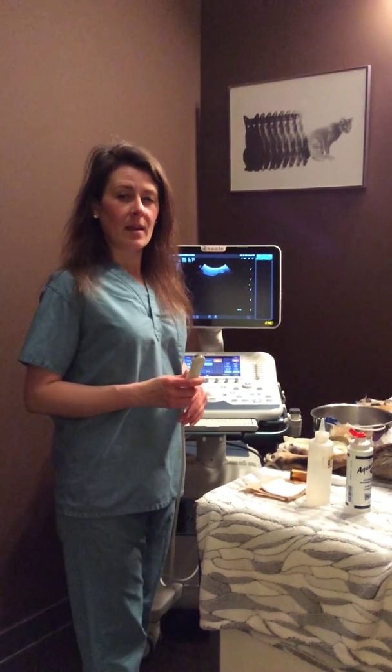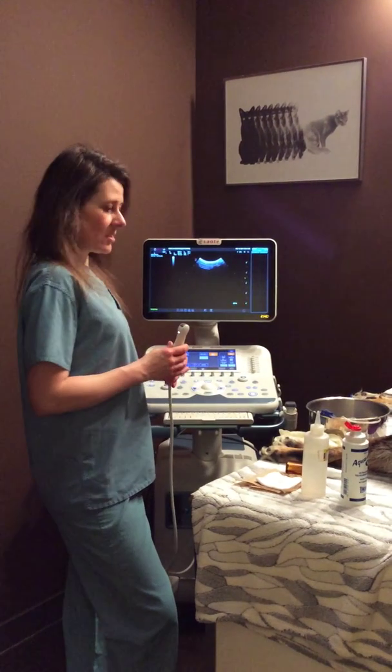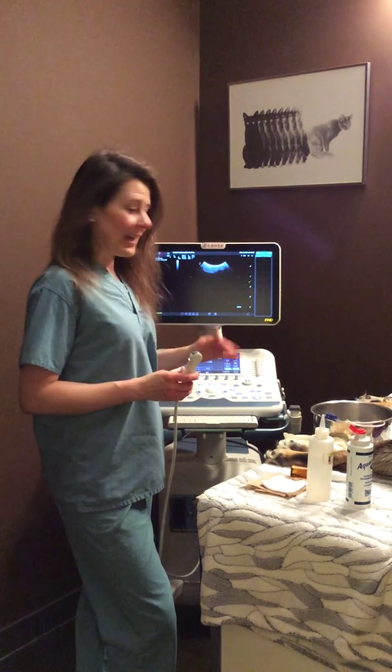The machine that we had lasted an amazing 14 years. We took really good care of it. So I decided to purchase the Esoté unit — it's called a MyLab 7.